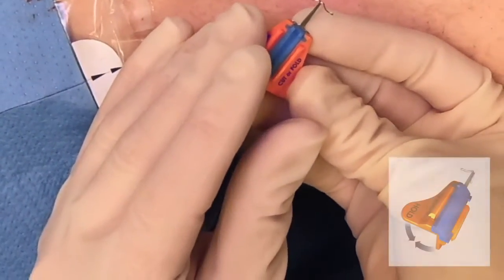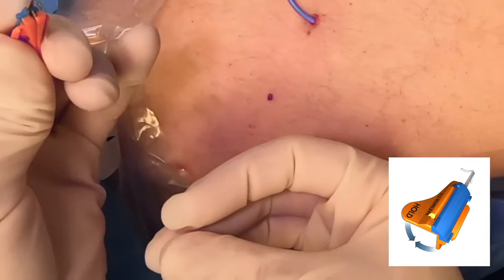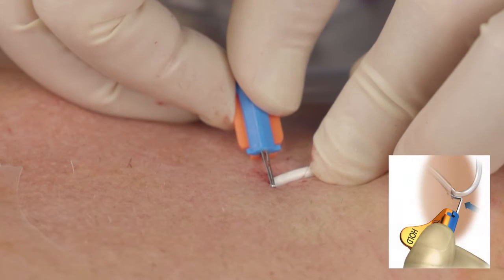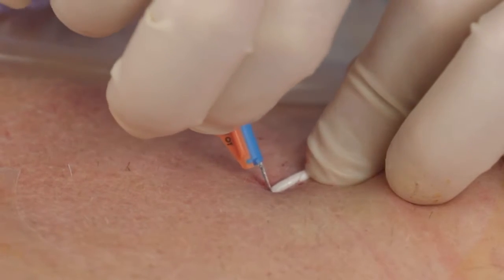Fold the SecuraCath base until the feet come together. Apply traction to the skin to help dilate the insertion site. Hold the folded base at an angle, aiming the tips of the feet at the insertion site. Turn the SecuraCath to the desired indwelling orientation.